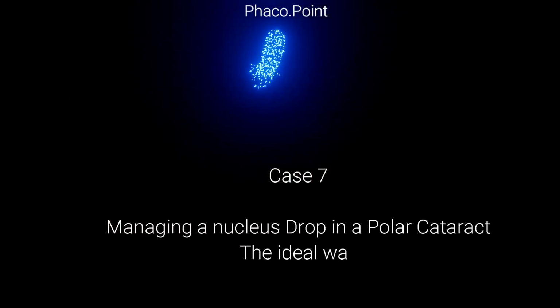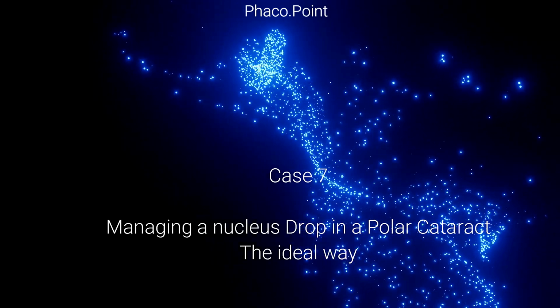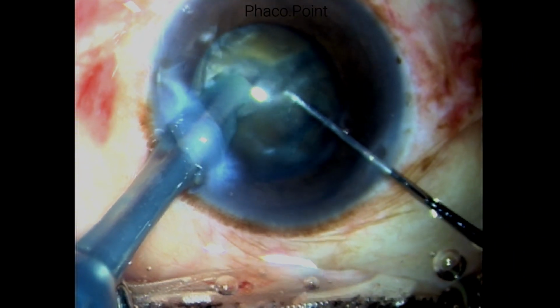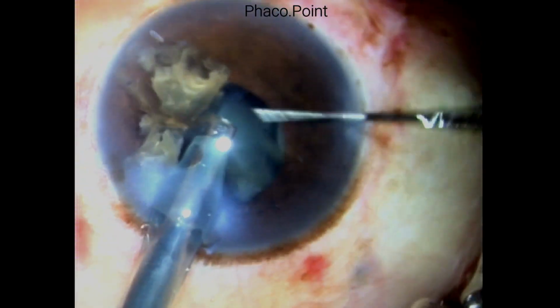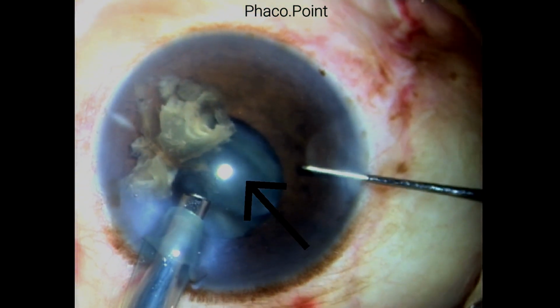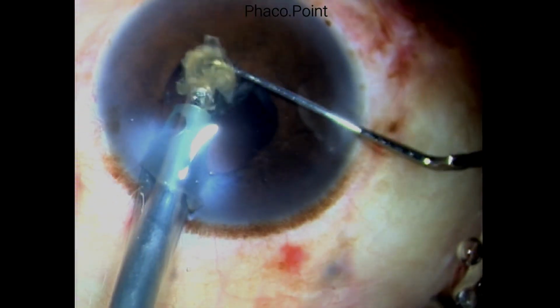The next case shows a similar occurrence, a grade 3 nucleus sclerotic cataract with the posterior polar element. I now proceed with performing a direct chop with a limited lateral separation, but whilst doing so, watch what happens. Midway during the nucleus emulsification, and most likely as a result of the intraocular manipulations itself, there is an opening in the posterior capsule which results in the dropping of one of the fragments into the posterior segment.